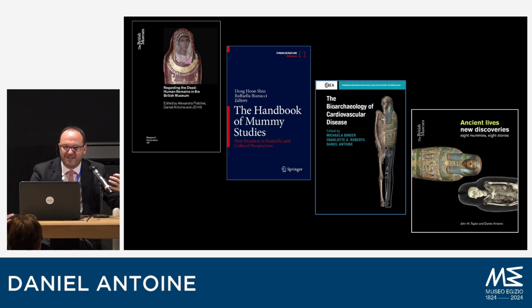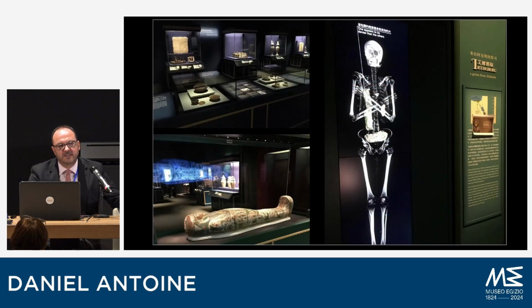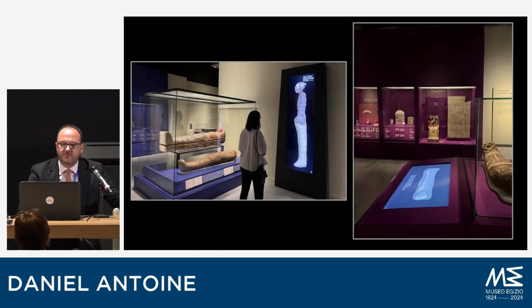But I think reaching academic audiences is one thing, but also being able to share this with diverse audiences is really key. And we've been exploring different ways, and we monitor the results. And we're hoping that in the future, like in the galleries upstairs, we'll be able to share the CT scan data in close proximity. This is in Valencia only a few weeks ago.